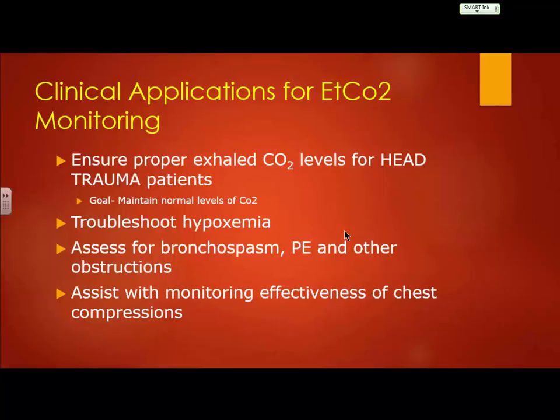my inspiratory, then I've got my peak and my plateau there. If this is normal, where when I breathe in I've got good volume, adequate volume coming out, so I've got a rapid increase, a rapid spike, that gives me a good indication that my ventilation is okay. Somebody that has bronchospasm or an airway obstruction, obviously we're not going to get a lot with the inhalation, but how is that going to affect expiration?